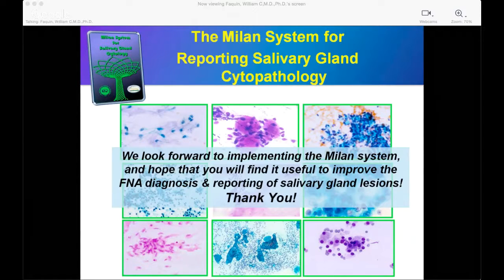You can get squamous metaplastic changes of the ductal epithelium. For those, I would say the hypocellularity and the small size of the groups can suggest that you might just be dealing with squamous metaplasia. More commonly, we'll see it in a pleomorphic adenoma, and squamous metaplasia is the most common metaplastic change in pleomorphic adenoma.